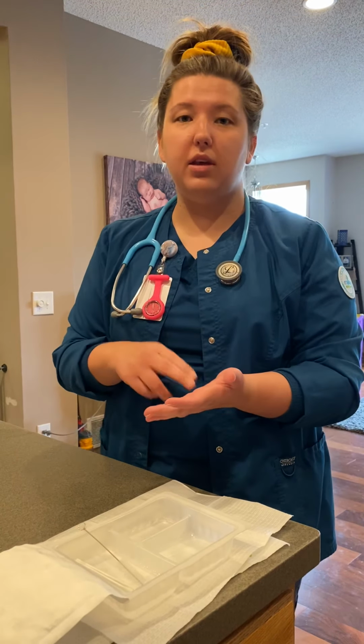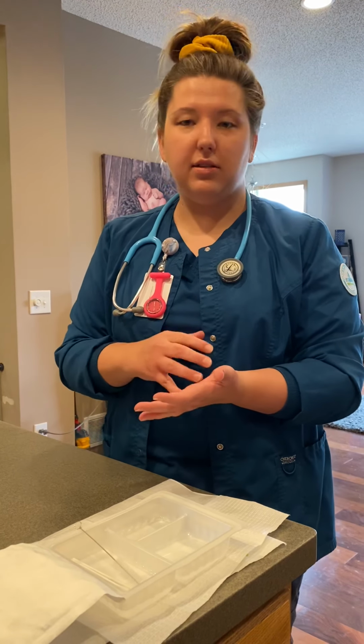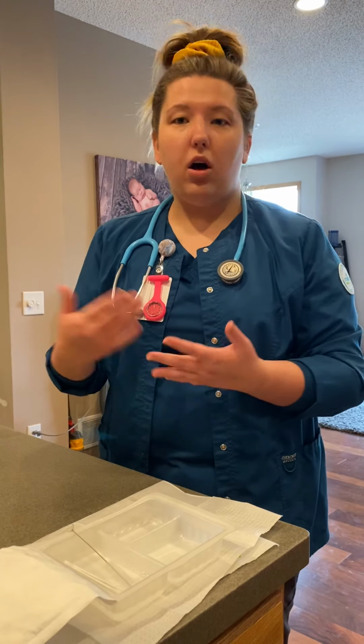I'd want to note the color, consistency, odor, and amount of the drainage from the dressing, also noting the size of the trach and everything like that. So that completes my skills. Thank you.